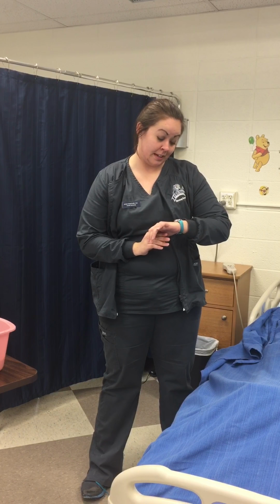Today's date is 1/18/18. The time is approximately 12:35 in the afternoon. Today I will be inserting a Foley catheter on a female patient.